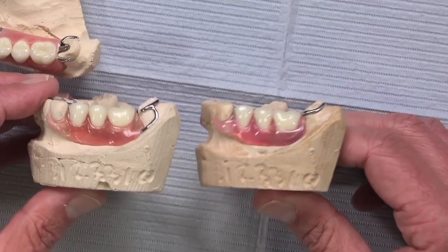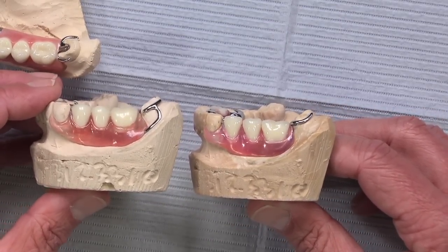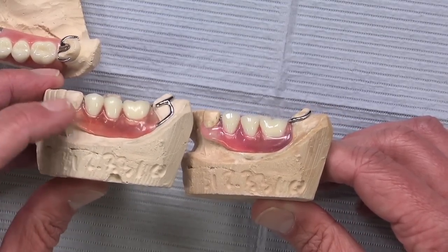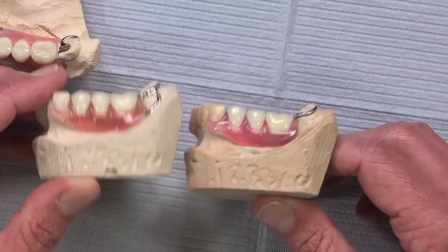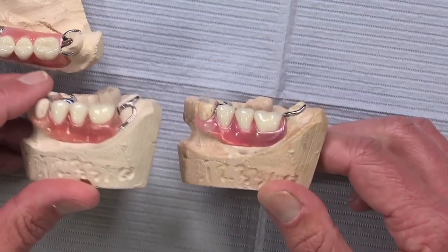And so it's kind of like putting a translucent Empress veneer on a tooth stump that's a desirable color. And part of the nice part is with it being translucent, the light will go in and light up everything. And the same thing happens here. The more translucent this is, the more the patient's natural tooth shade comes through. And we do have a couple different colors in the Duraflex.